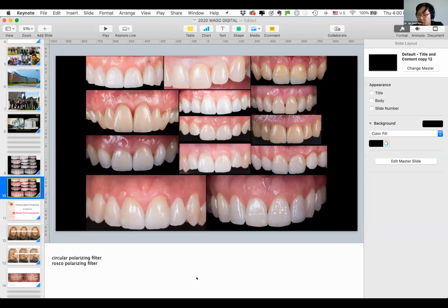I use microfiber pockets I have, so I put them in those pockets. After I use them, the assistant washes it with soap, and they clean off the mirrors. They dry it, they put it in the pockets, and then we sterilize it. If you wrap it up in a paper towel, it does scratch the mirrors over time.